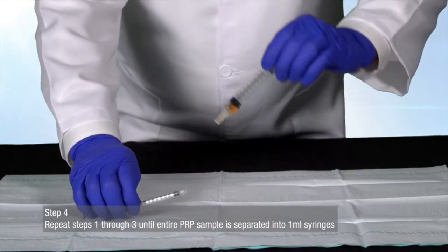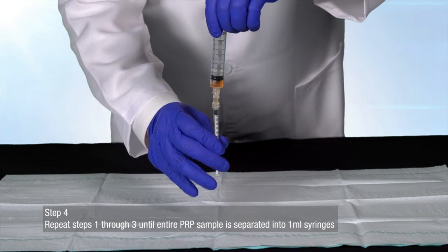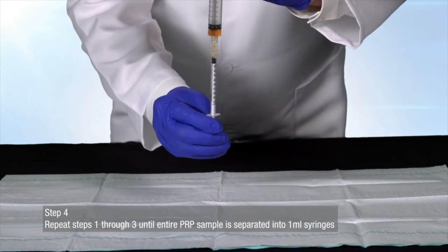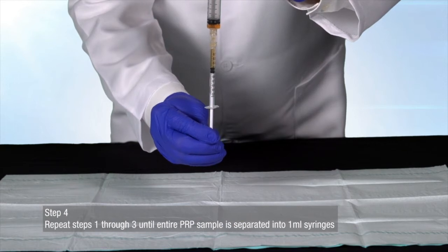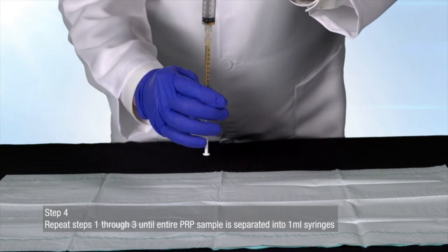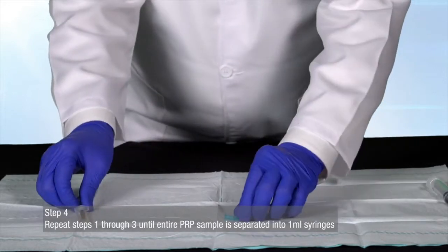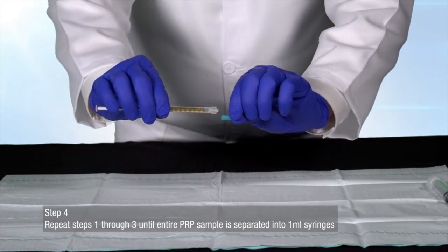Repeat steps 1 through 3 until the entire PRP sample is separated into 1 milliliter syringes. Your PRP is now ready to be inserted into the Regenerative Medical Plasma Bio Incubator to be prepared into platelet-rich fibrin matrix bio filler.